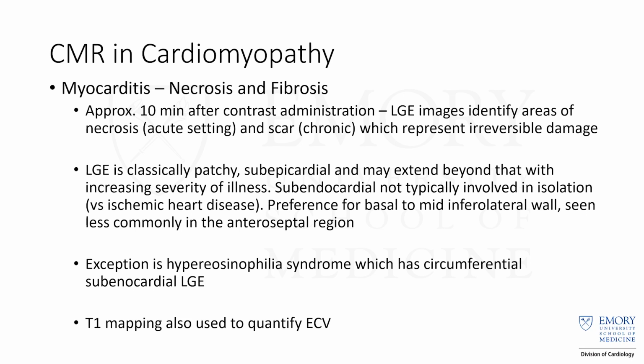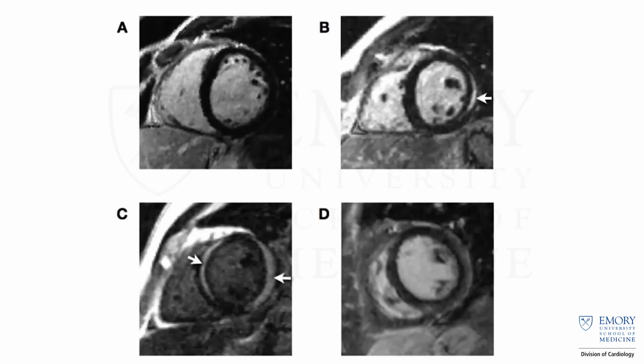And typically we see this in the basal to mid infralateral wall, which is the most common area where we see this in myocarditis patients. So here's the epicardium here, and you see this subepicardial enhancement on the delayed images, which is consistent with myocarditis.